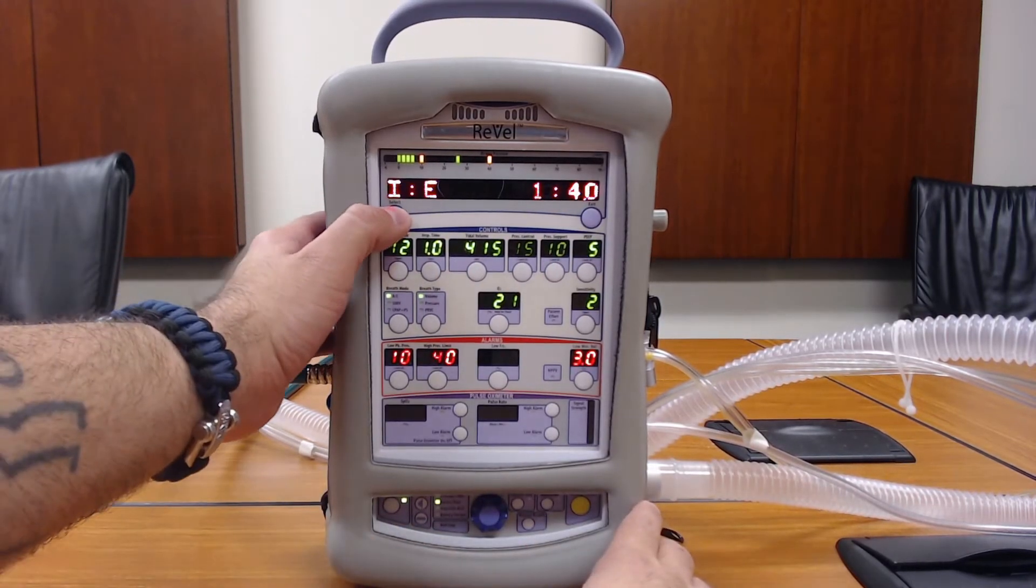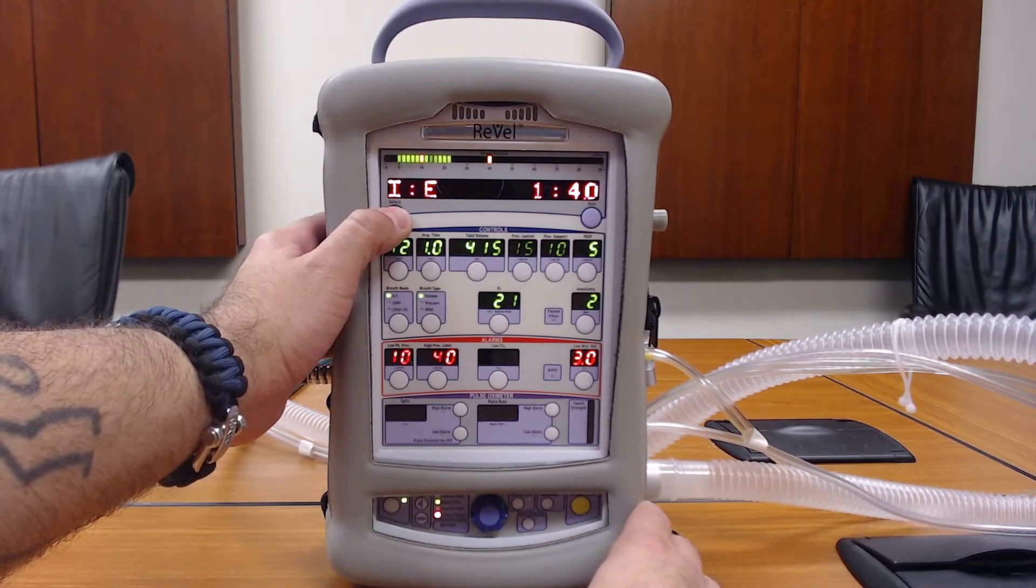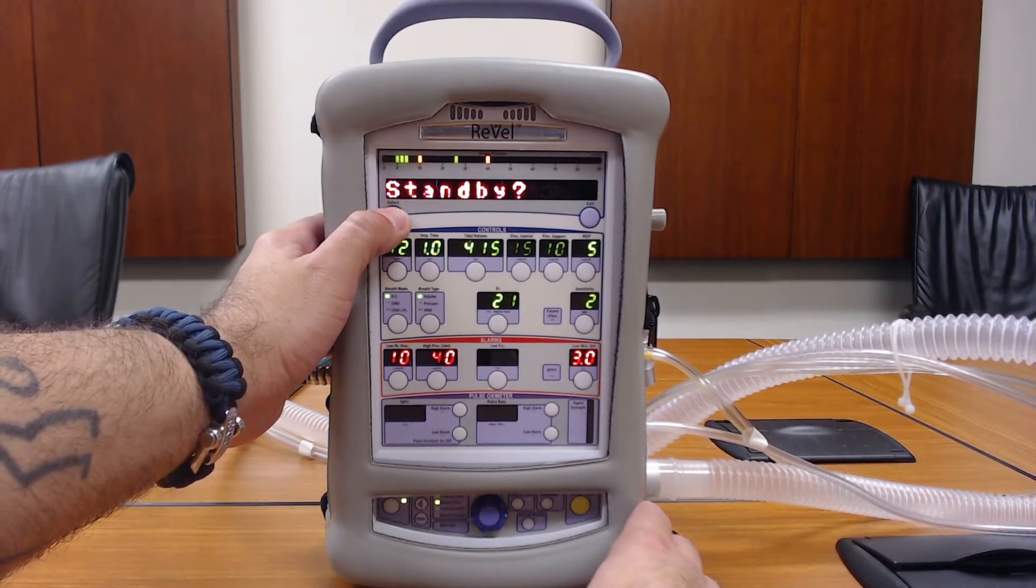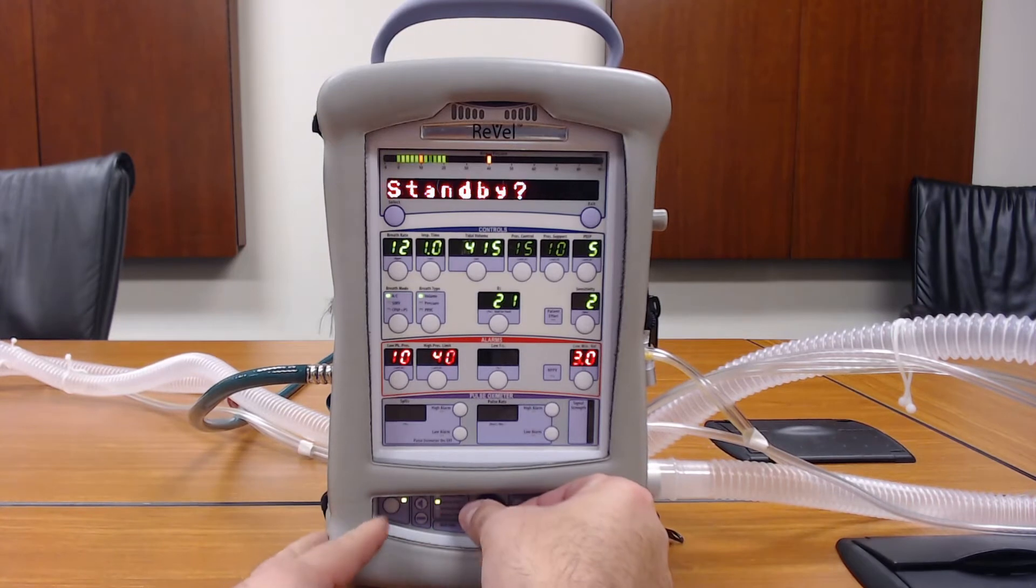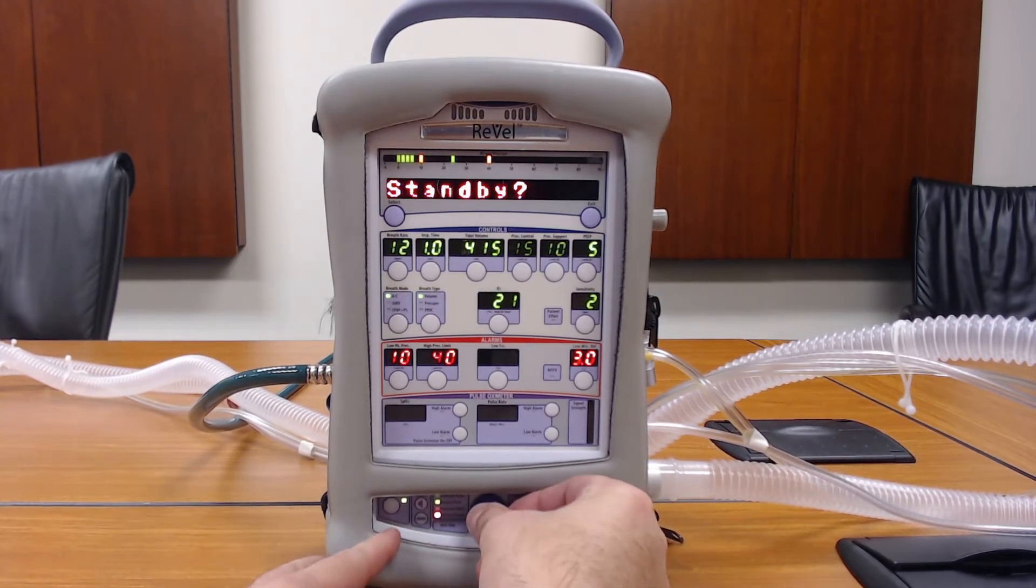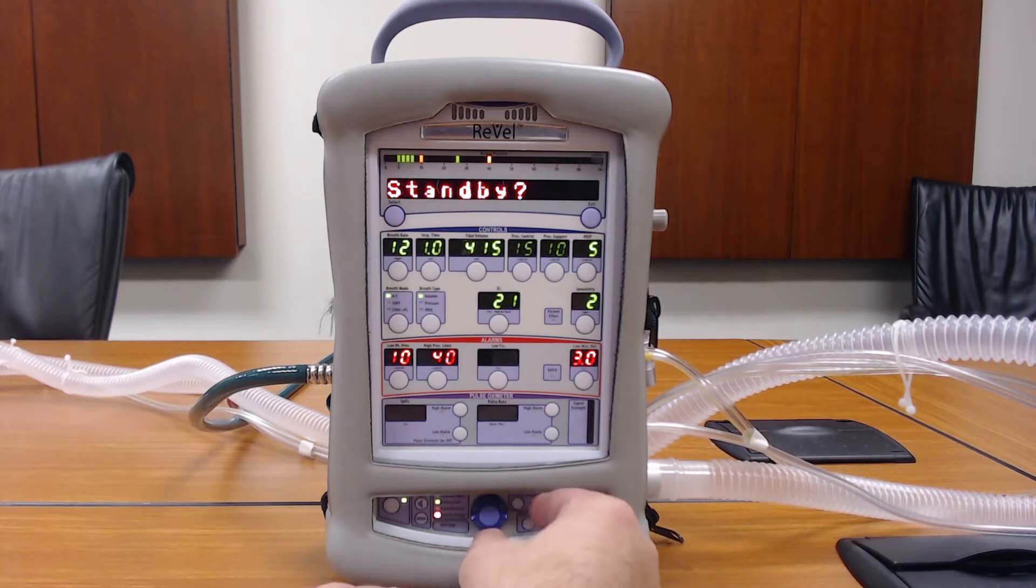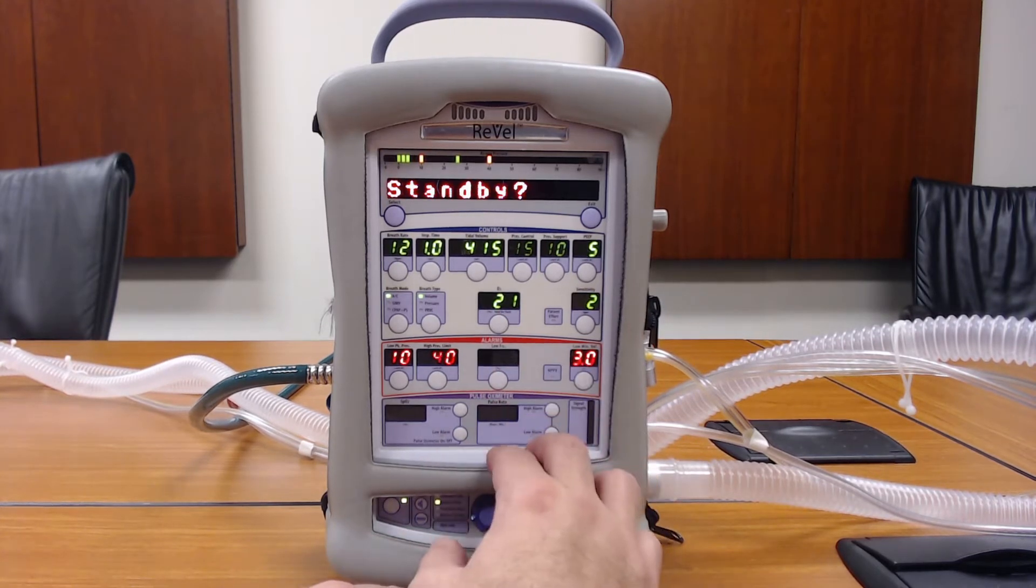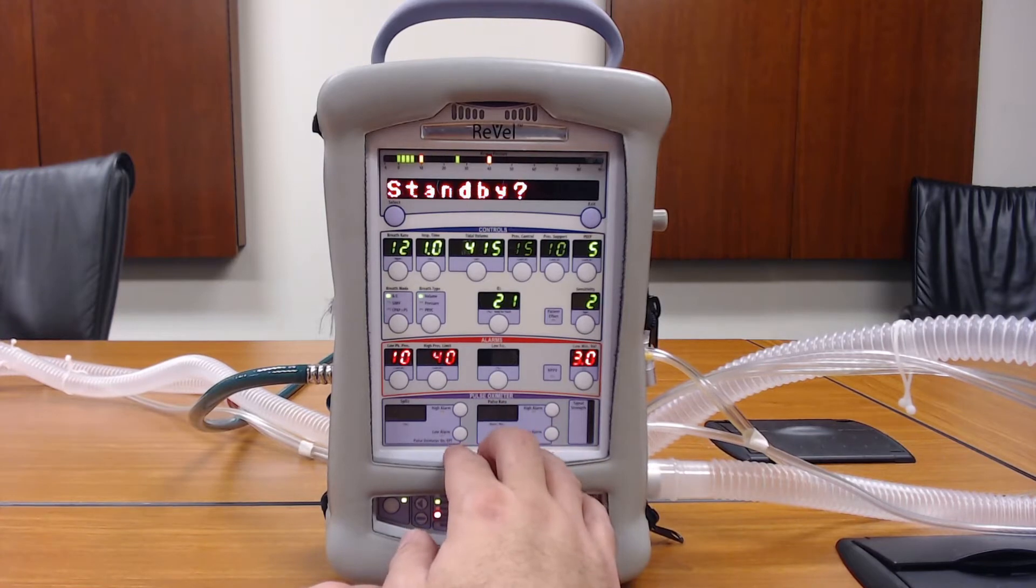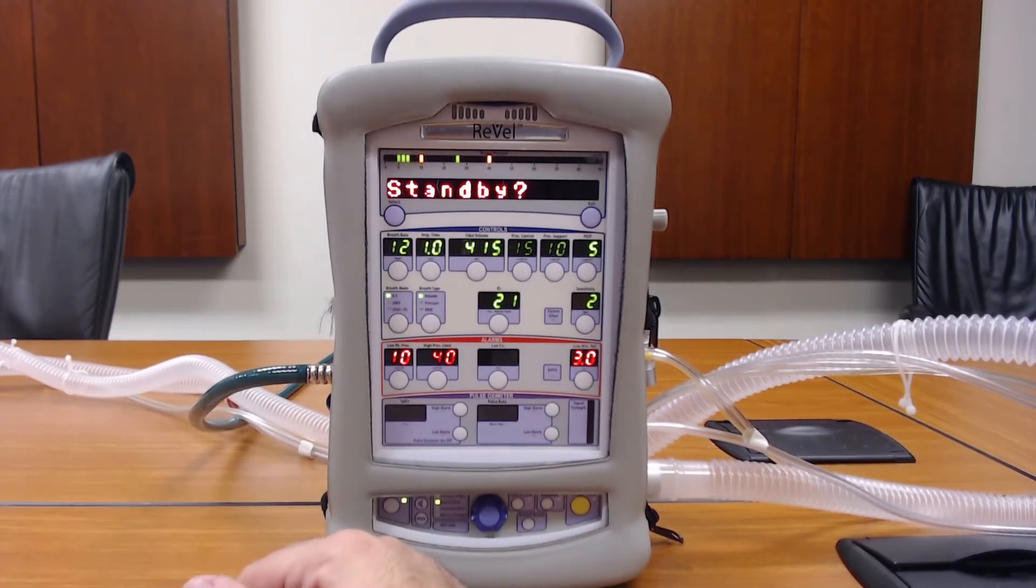You're going to want to hold the select button down for about three seconds and then the standby will pop up. This first menu will allow you to put the vent in standby mode while leaving the vent on, so it will cease ventilator operation but the unit will stay turned on.